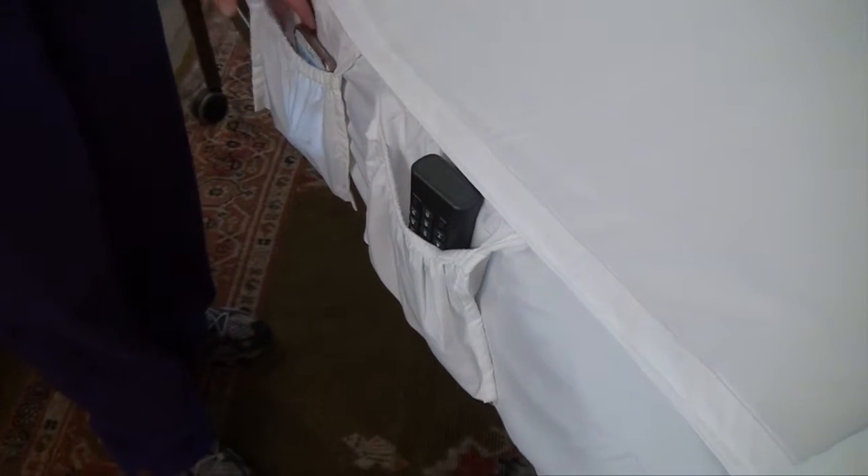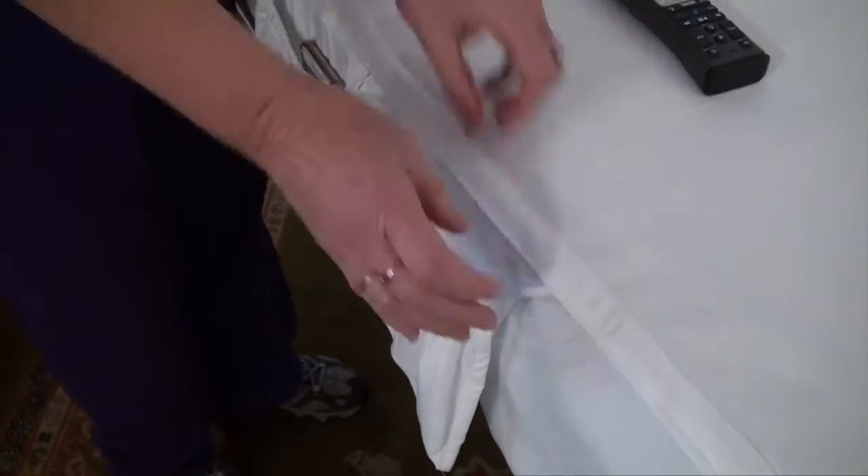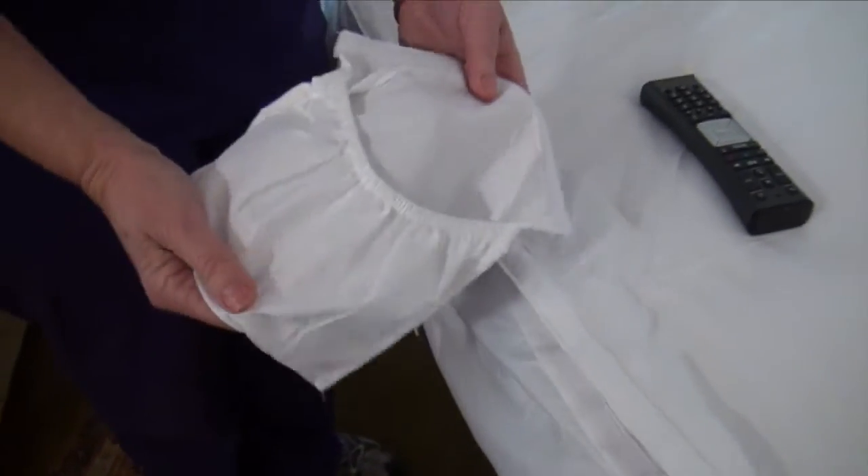How many times have we lost remote controls and glasses — even dentures? I can put that right here in this pocket, and the pocket comes off so I can wash it if it gets soiled. It really is simple for both the patient and the nurse. It's that simple with Simple Sheets.